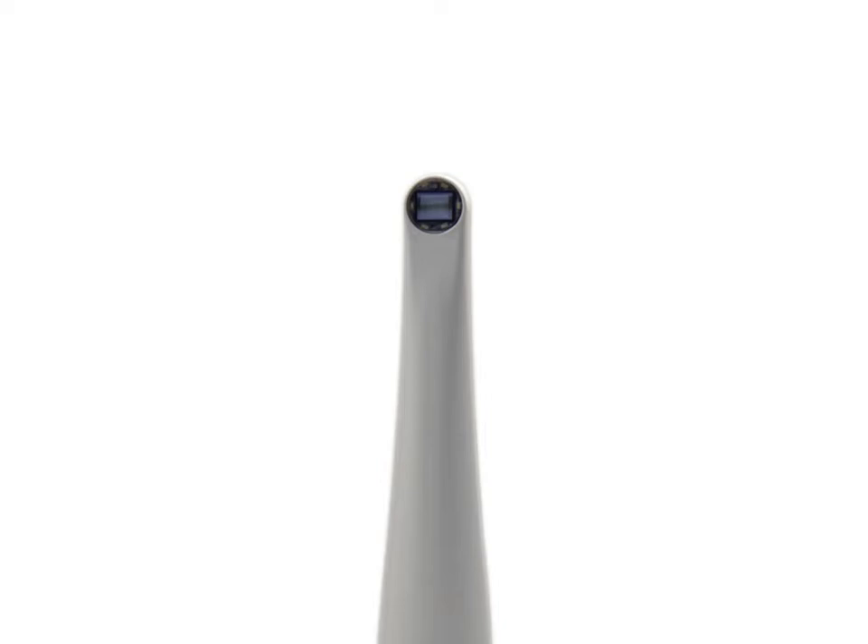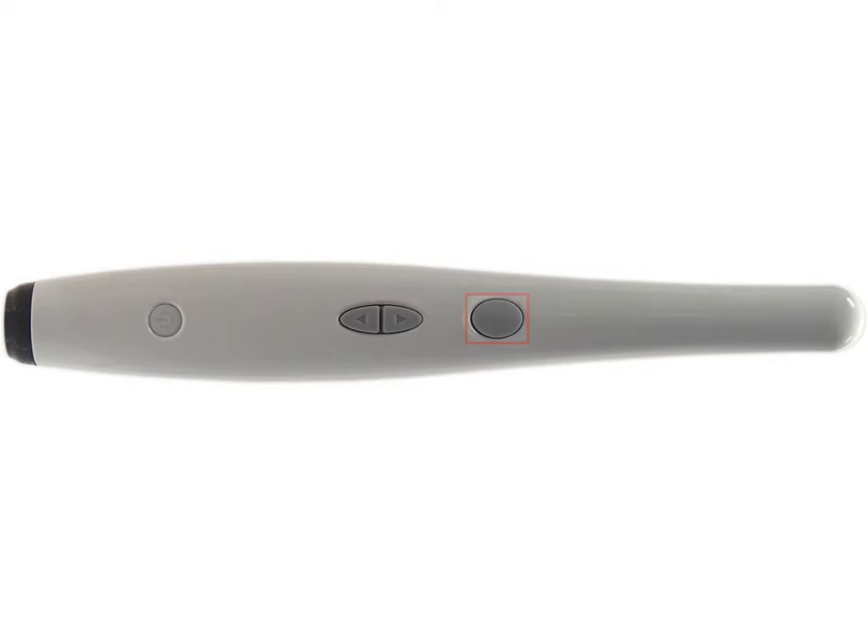The LEDs illuminate the area of interest. The camera lens has a fixed focus. Further down the camera body, you'll find a capture button.